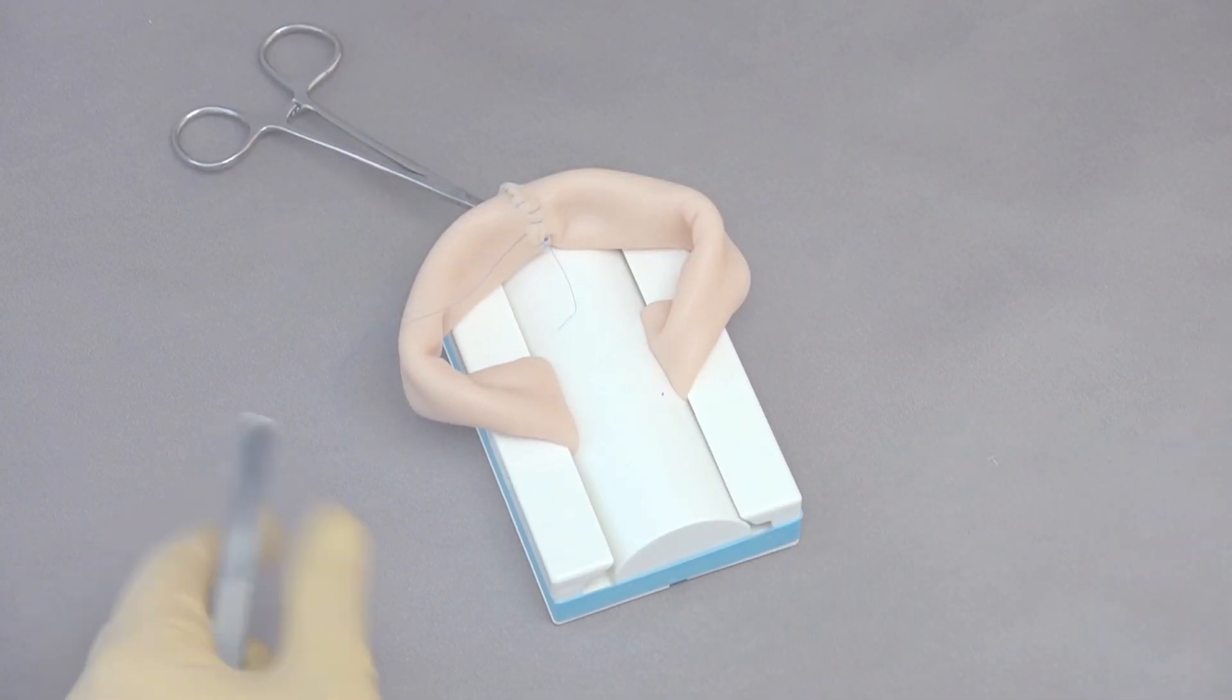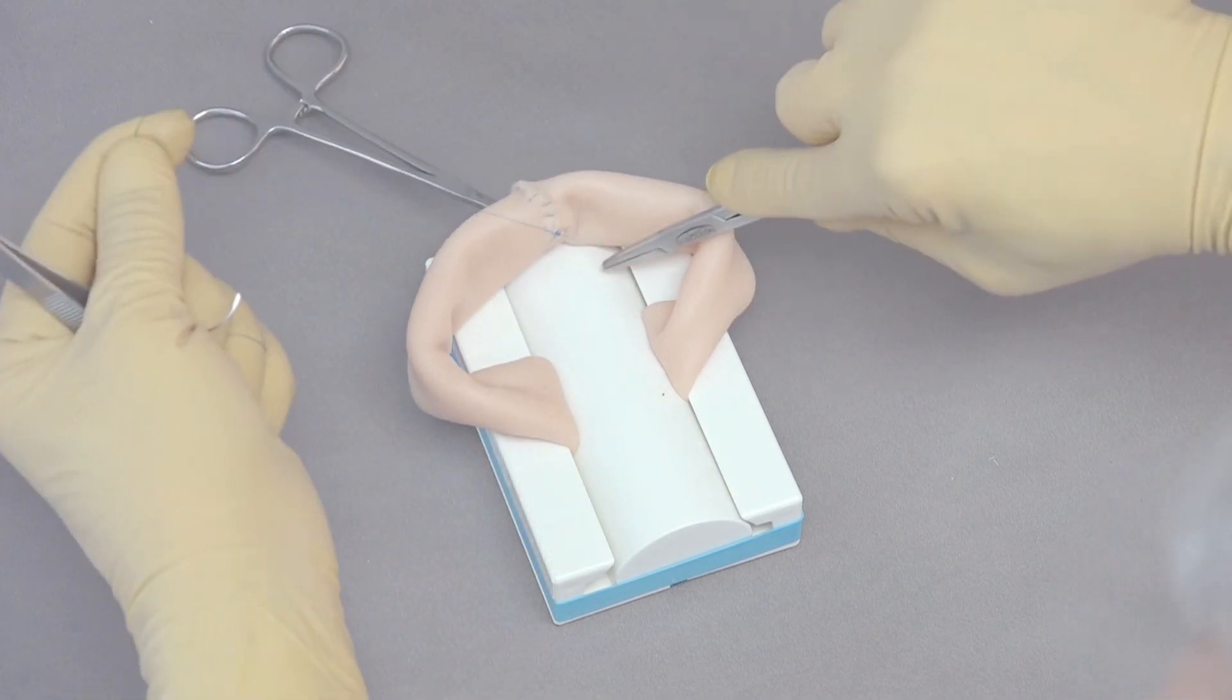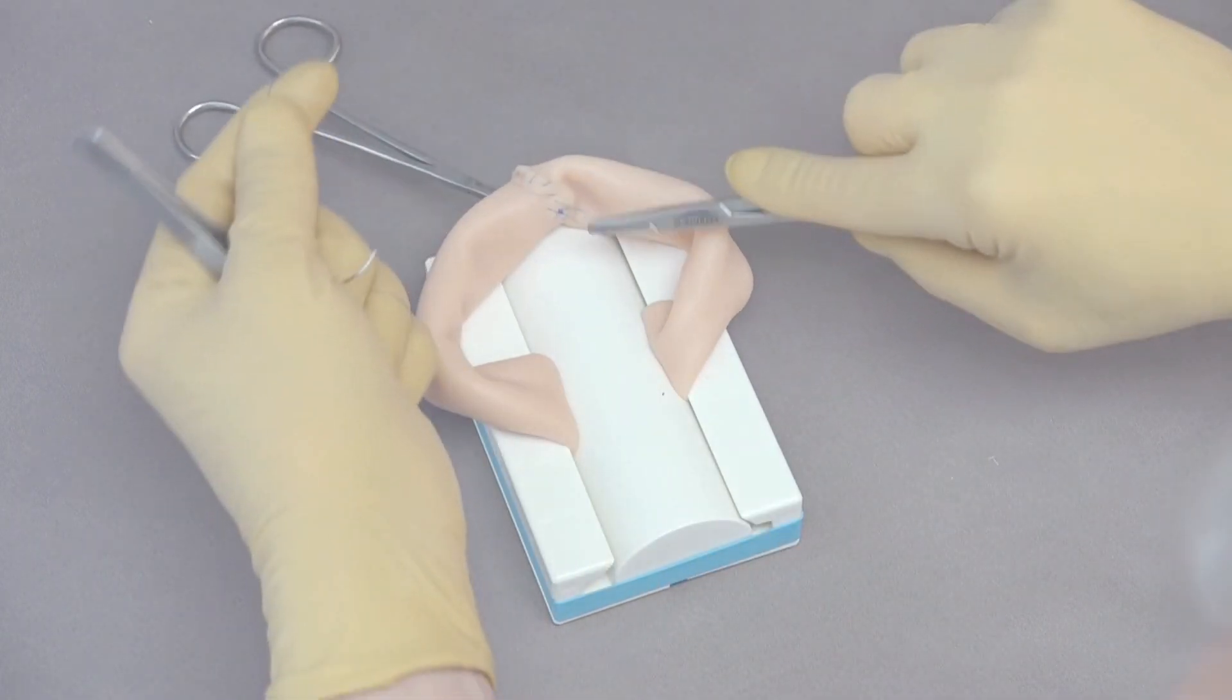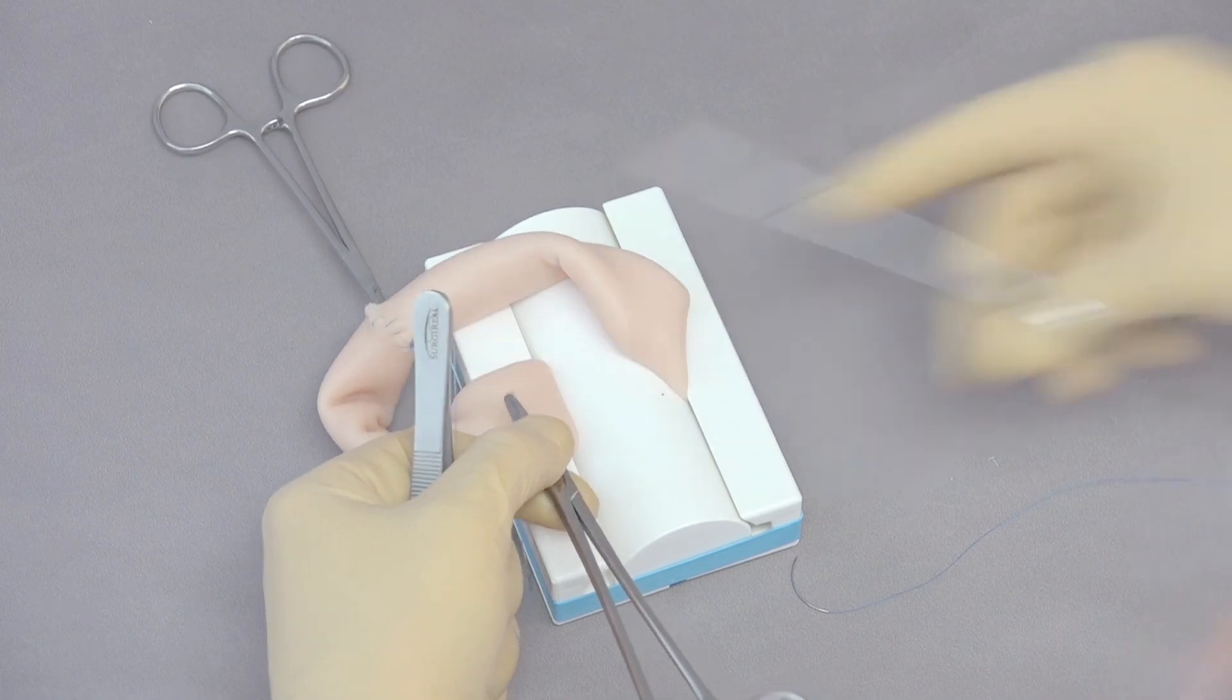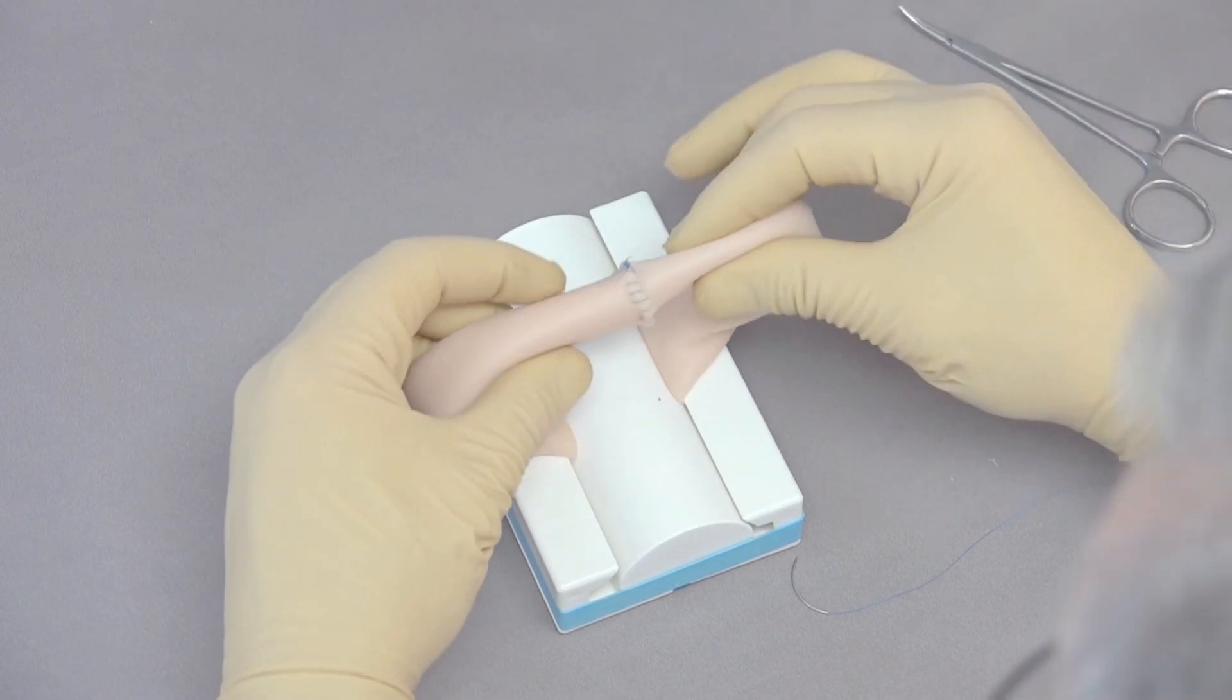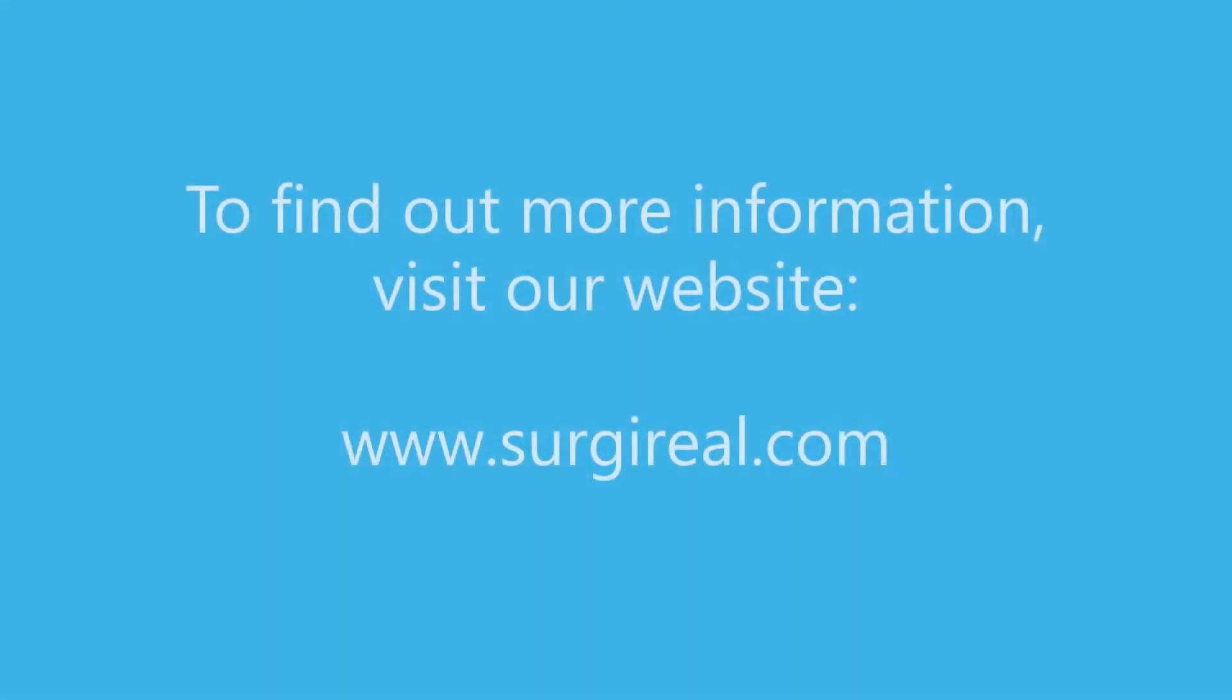I can finish up by taking off the hemostats on this stay suture, making a square knot. We're going to cut these short so that we're leaving them only a couple of millimeters long. And you can see that we've now got a complete anastomosis of the small intestine.